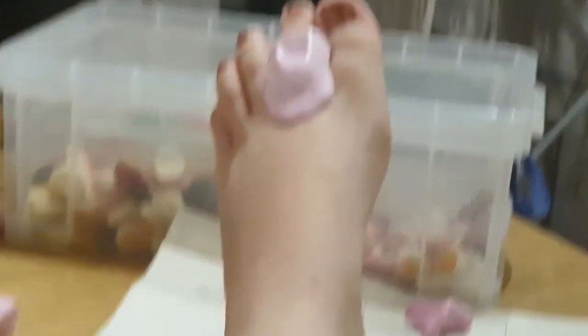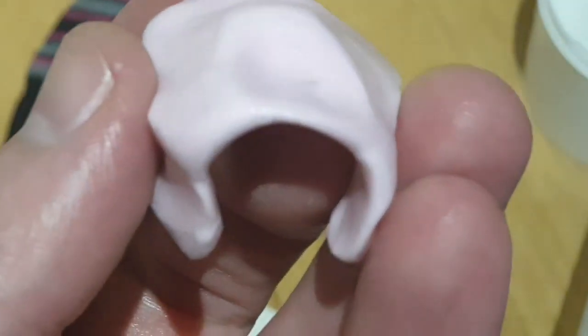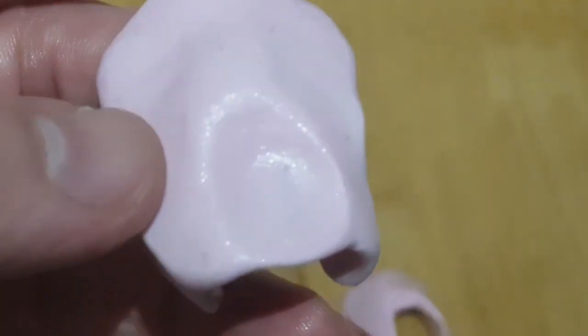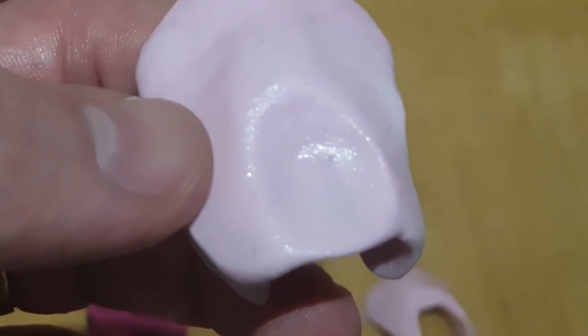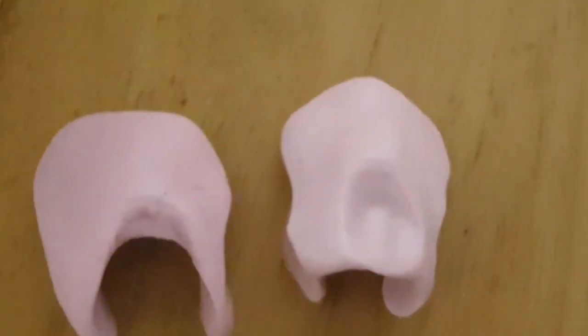So now you've got a similar sort of shape in that you've got the divot there and the hump behind it, but this time you leave a thin layer of silicon over the corn itself. Taken off, it looks like that — there's no thickness to it in the middle. That's just if you want to do something to actually directly cover the corn. Bear in mind that a lot of those dorsal corns can be quite fragile and quite dry skin — that's not a bad way to stop them drying out. So that's two different types of dorsal prop.